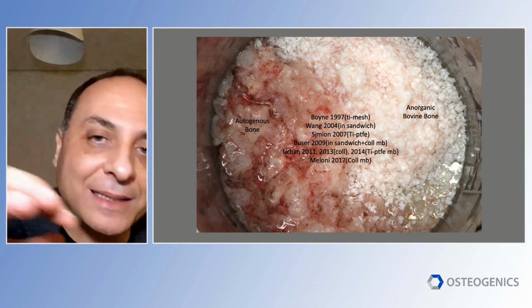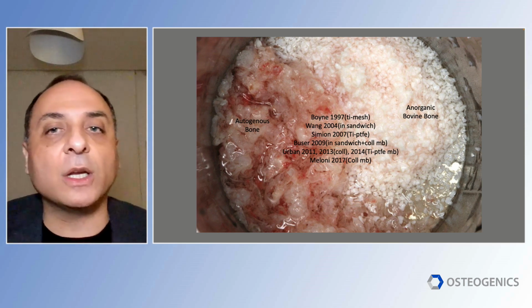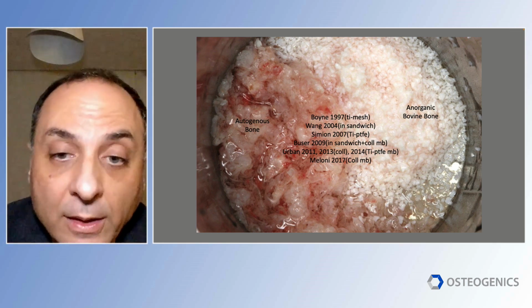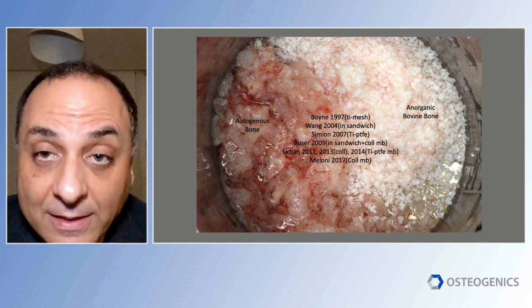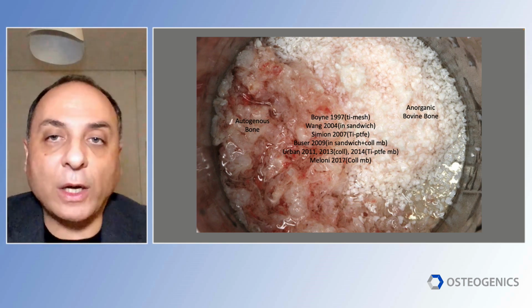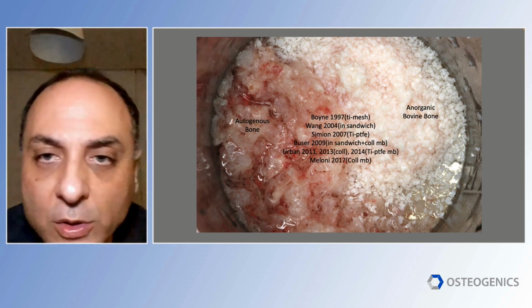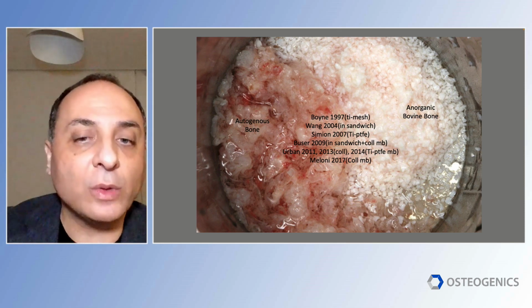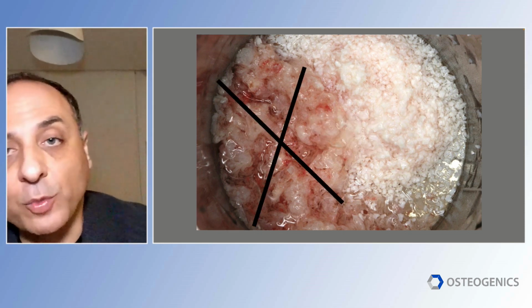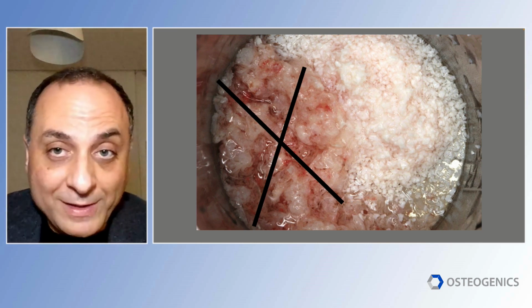It's going to be like the stabilizer. It's going to be the component inside this graft that's going to give the graft some stability. And this was something that was advocated by Simion in 2007, by Boyne, where he was reconstructing full arches with the titanium mesh. So very famous maxillofacial surgeon. So it was proposed by so many people. So I thought to myself, why wouldn't I do the same?